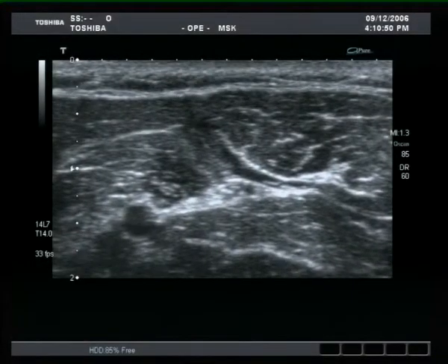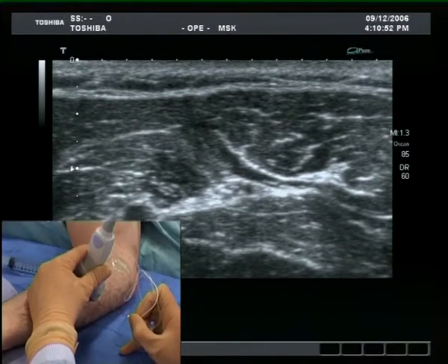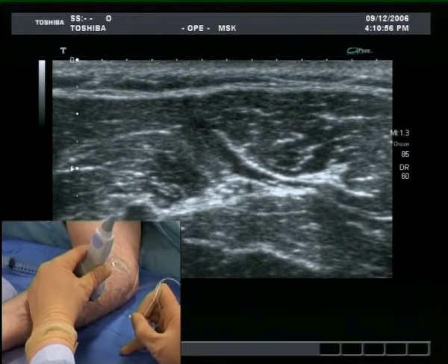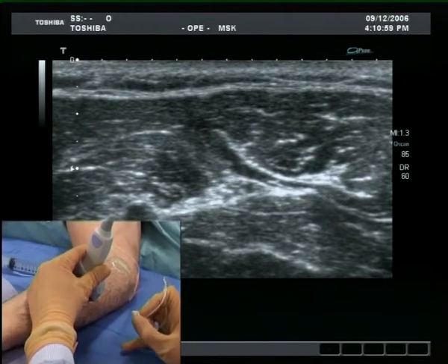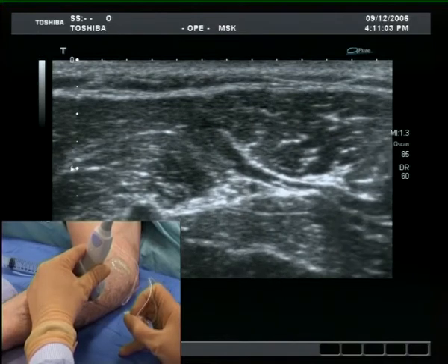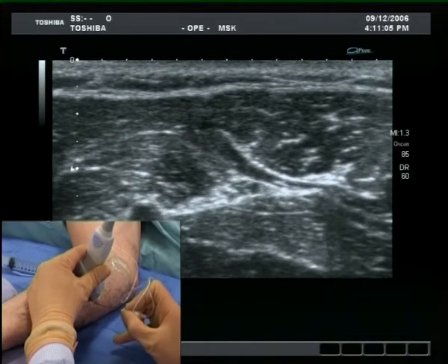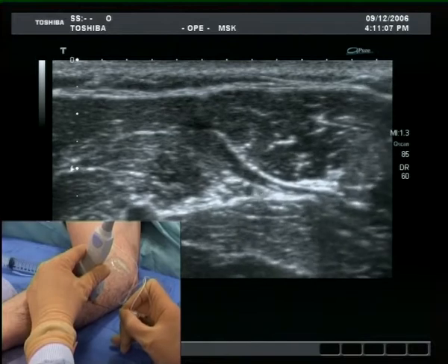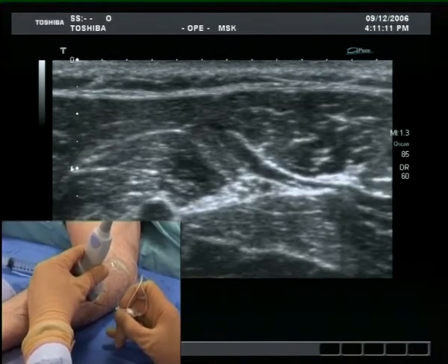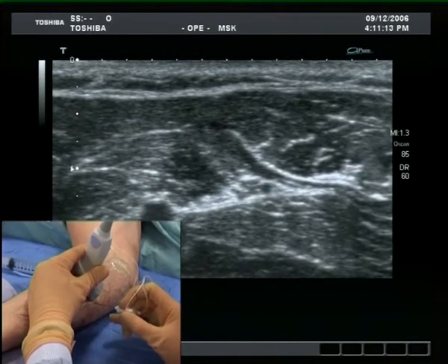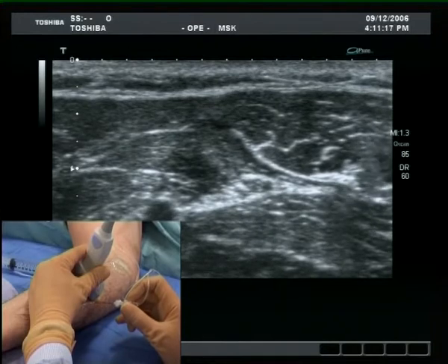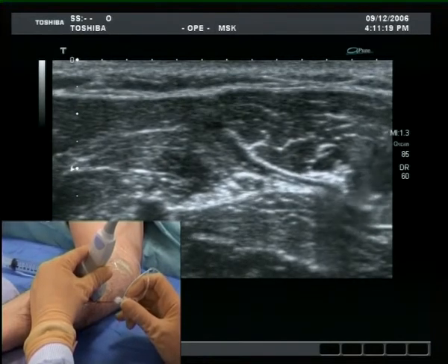In this clip, the needle will appear from the right side of the image. The needle is carefully introduced into the ultrasound beam. Very small adjustments of probe angle and needle position may be necessary to improve needle visibility. The needle is visible as a white line traversing through the flexor carpi ulnaris.